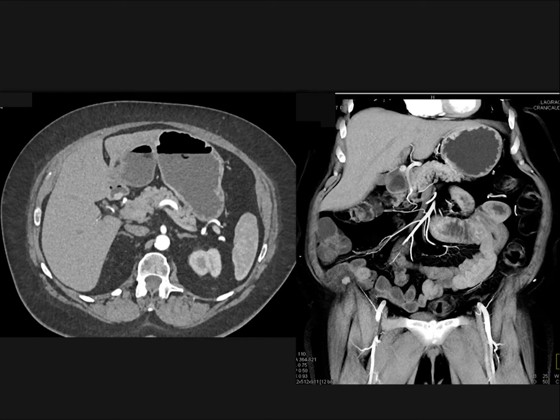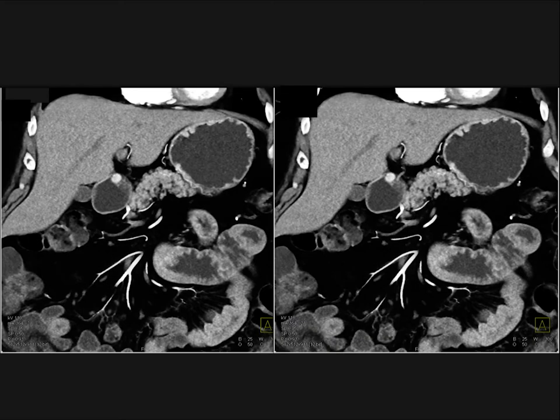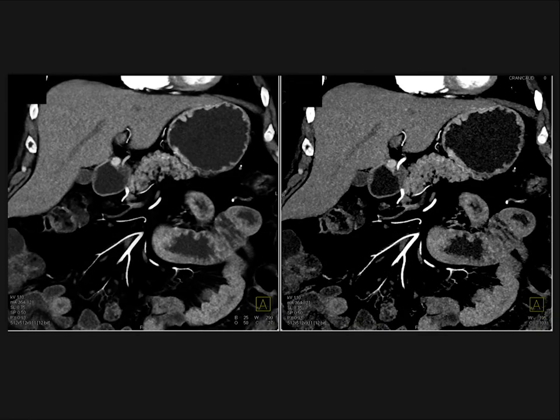And I think that's the point, that if you are able to image correctly, it's easier to make the diagnosis. Here's another set of images, same patient. Again, the arterial phase, and here is the venous phase. You see them in both phases. You see several things, how the coronal 3Ds are very helpful. You see how the coronals are very helpful.